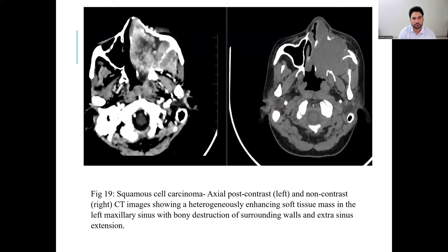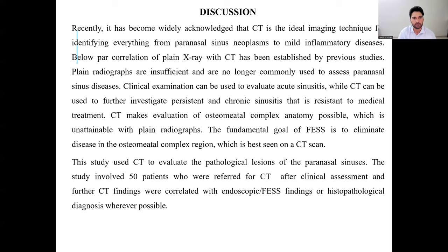A case of squamous cell carcinoma shows axial post-contrast on the left and non-contrast on the right CT image, demonstrating a heterogeneous enhancing soft tissue mass in the left maxillary sinus with bony destruction of the surrounding walls and extra-sinus extension.